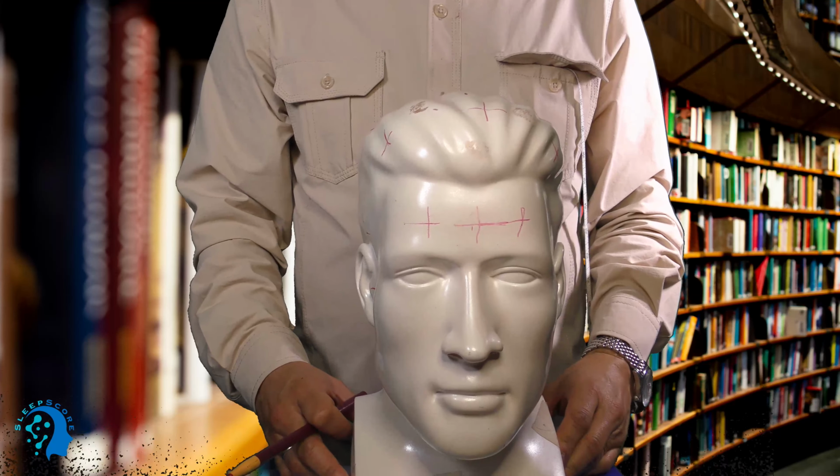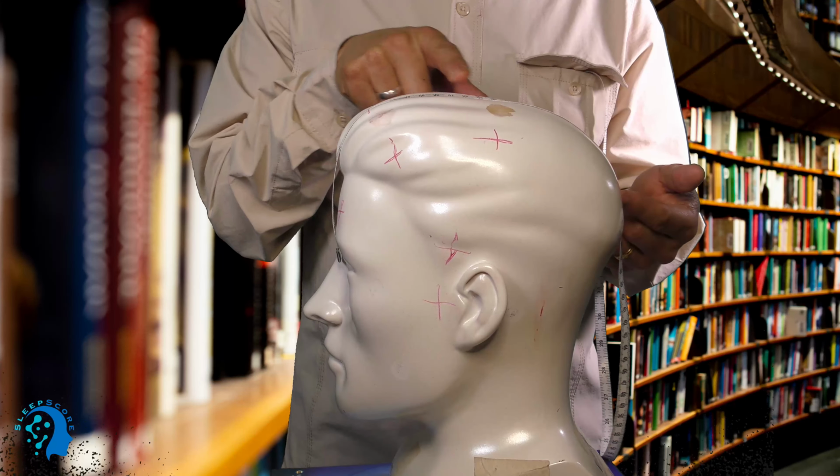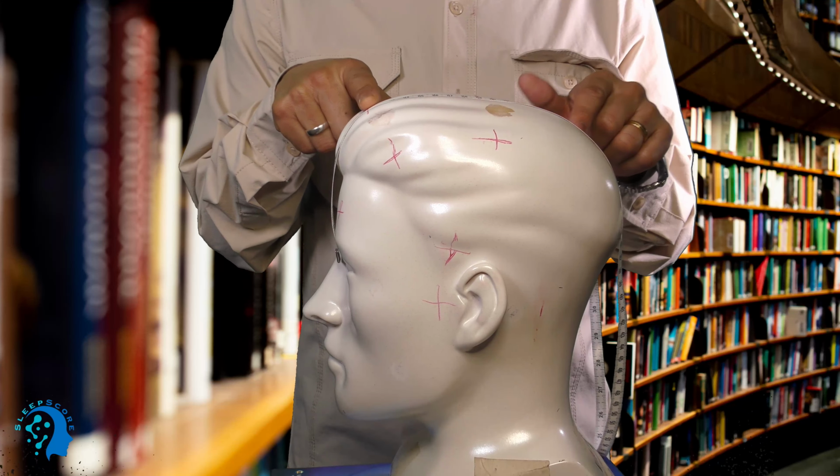Then from the center, I went 20% on either side. So first, Nasion to Inion, half, 10%, 10%, from center 20%, 20%. If you want, you can go 20% from here to here too. It's the same thing. All right, the z-axis is done.